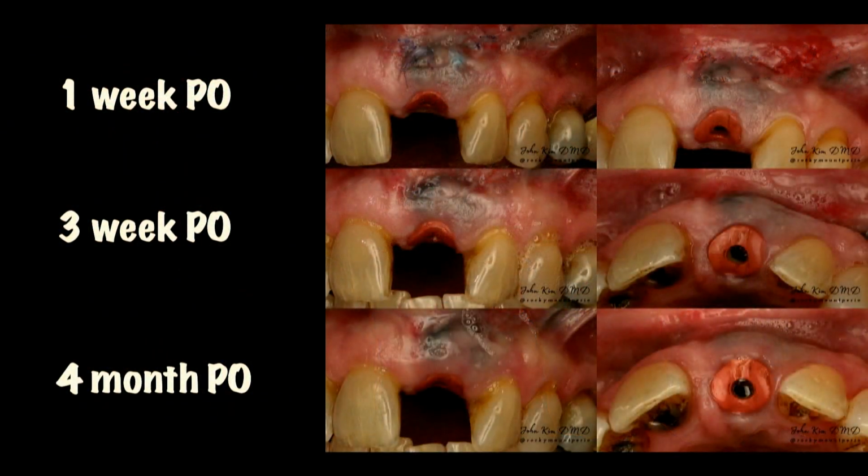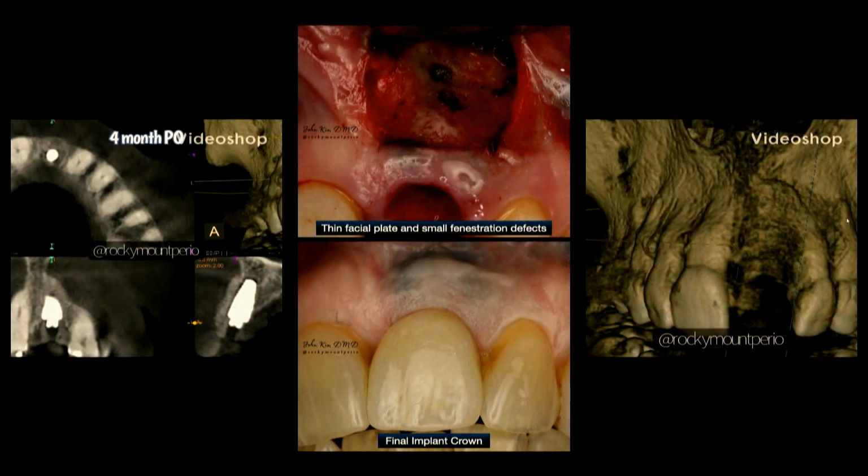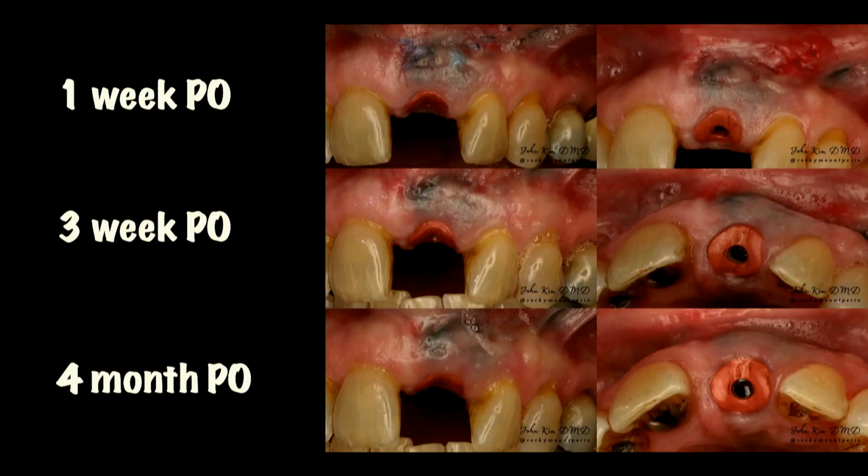And let's see how it looks healing. Oh, I hope I didn't go too fast. I'm sorry. Let me go back. And so healing went very well. One week out, I was even able to remove all the sutures, as you see in the top right photo.